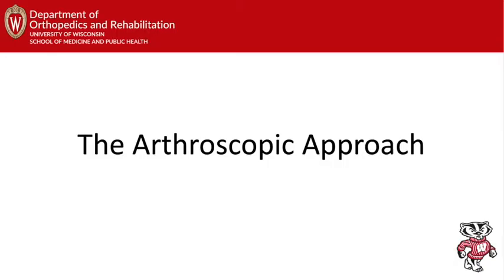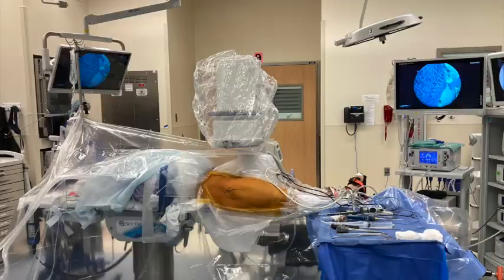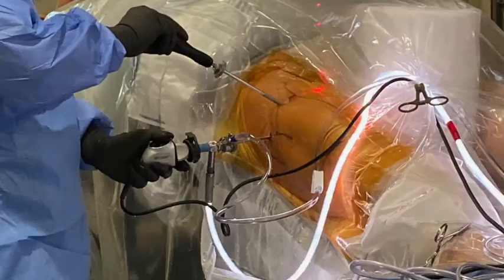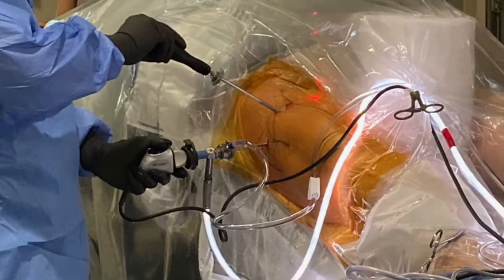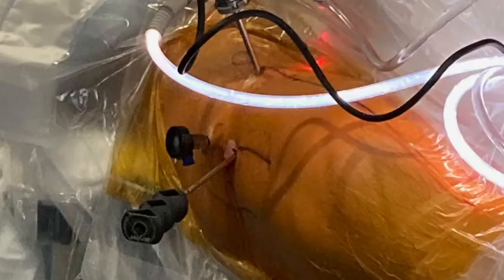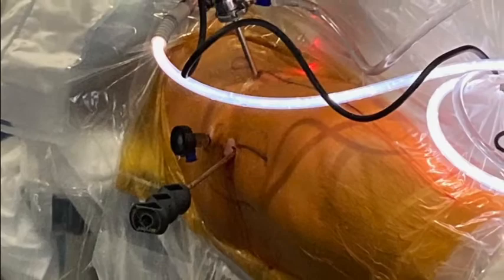The arthroscopic approach is performed with a standard hip arthroscopy traction table. The senior author's current preference is postless traction, but a post can be used. Standard anterolateral, anteromedial, and distal anterolateral portals are used.